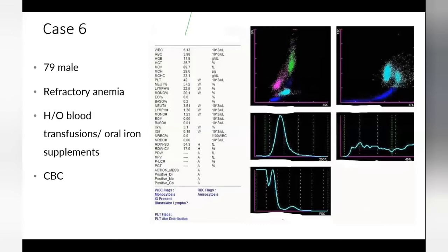At this stage itself, I would in fact go back and look at some research parameters on this particular cell analyzer to see if it's giving me some more clues or information about some kind of abnormality that's going on. What I did in this particular case was I found the scatter plot absolutely abnormal, and I thought the monocytes also looked very dense. I wasn't sure if they were all going to be monocytes, and also the distinction between the lymphocyte and monocyte regions over here is not completely delineated.